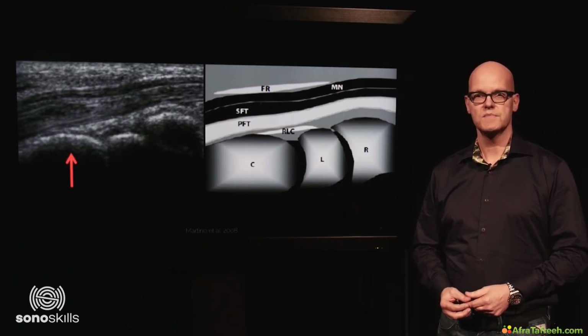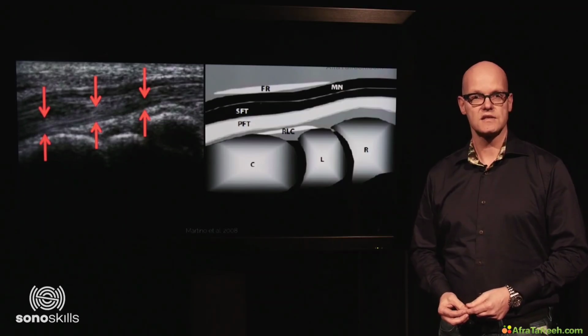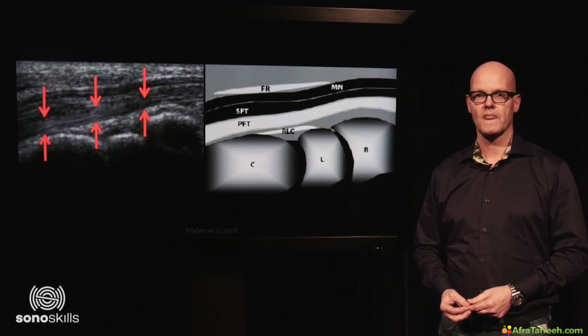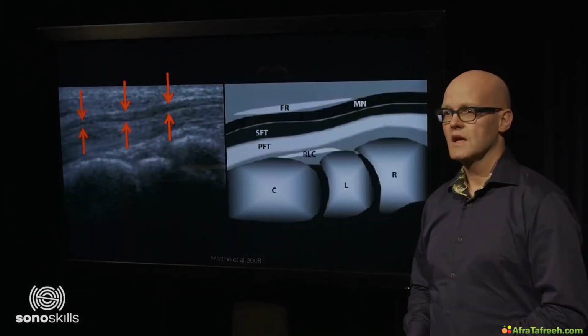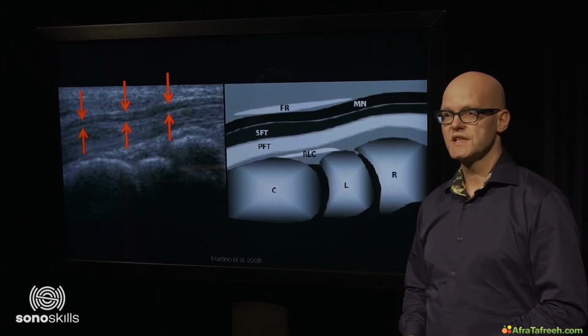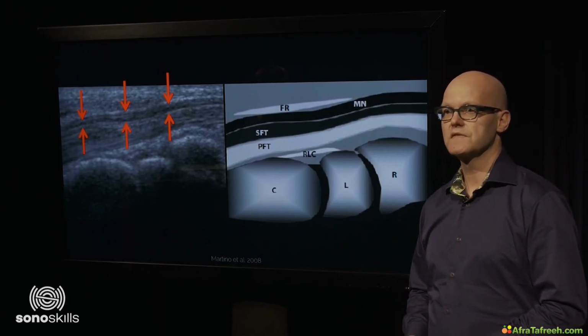These bones are connected by the radio-lunocapitate ligament. The myology that can be seen is the tendon of the flexor digitorum profundus, the flexor digitorum superficialis, and the neurology present is the median nerve, which can be seen slightly more hypoechoic than the tendons of the flexor digitorum.